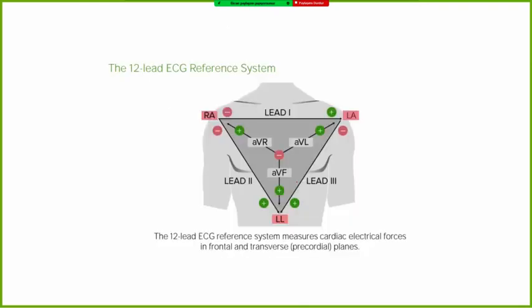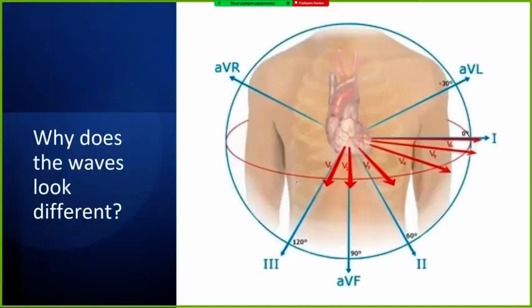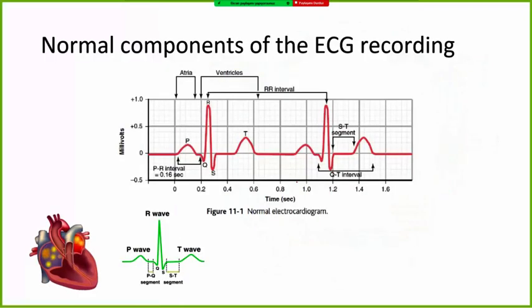And this again gives us the opportunity to evaluate the heart from every angle that is possible. These different derivations allow us to see these different angles of the heart walls.